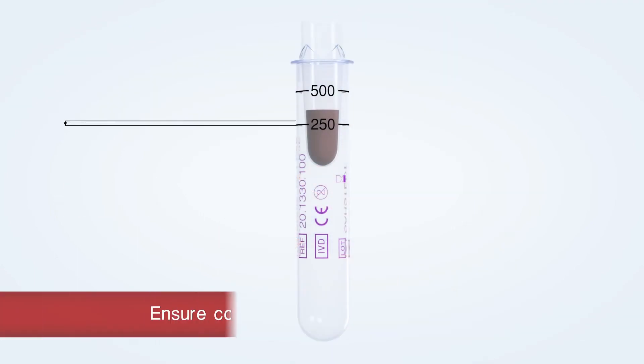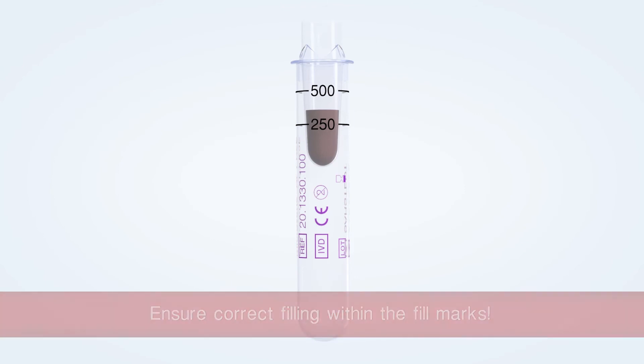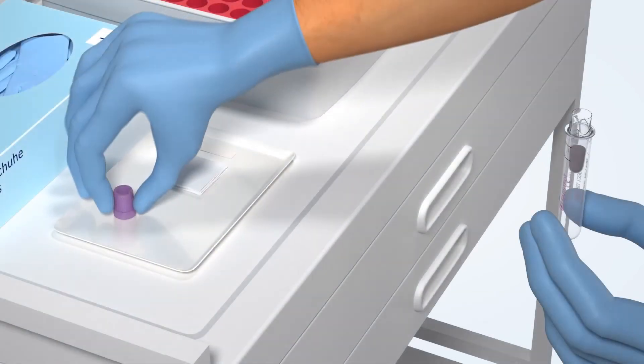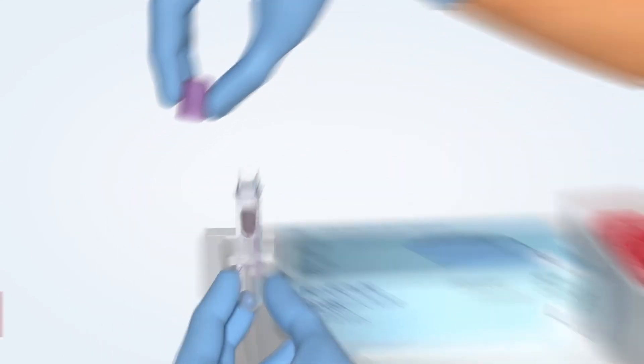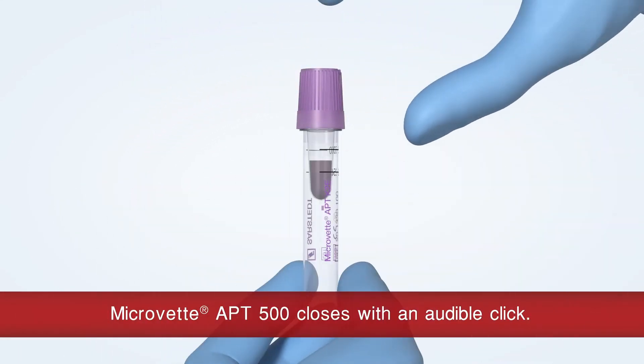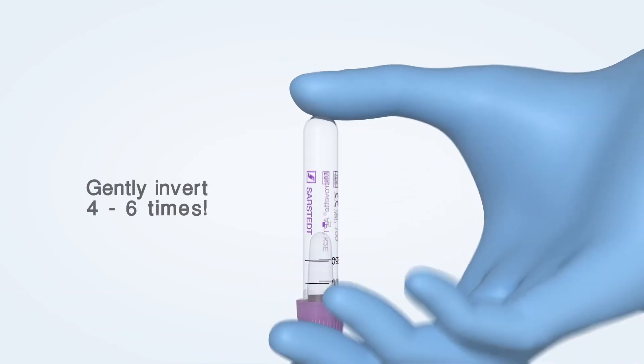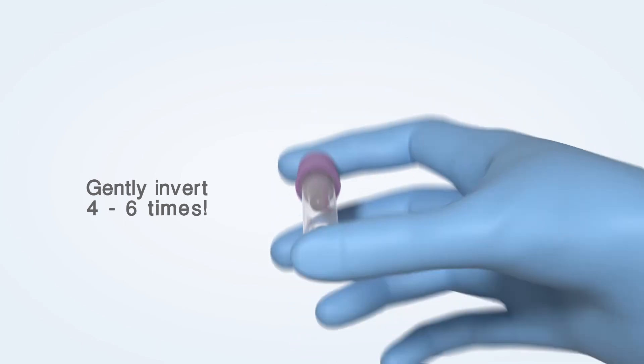Ensure correct filling between the 250 and 500 microlitre fill marks. Take the cap and close the MicroVet APT with an audible click. Gently invert the MicroVet APT four to six times.